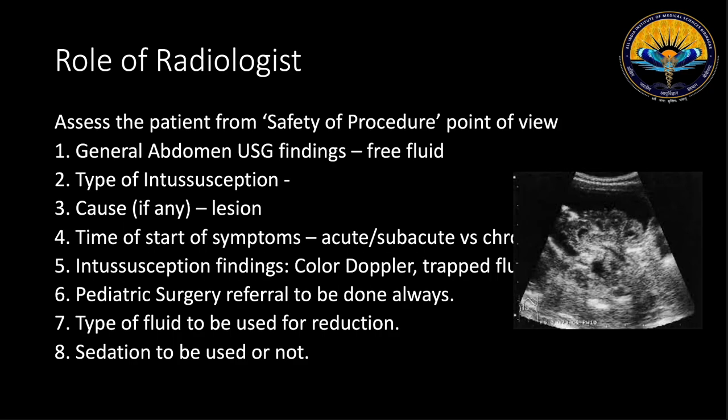Now, sometimes a child can be in great pain, and it may be difficult for us to reduce it without sedation, or the patient could be really uncooperative. So in those cases, sedation can be used. However, we have to keep in mind that when we sedate the patient, the increased intra-abdominal pressure which the patient would put, or the Valsalva maneuver during the procedure, will decrease. So the sedation reduces the intra-abdominal pressure which otherwise would have been put by the patient himself or herself.